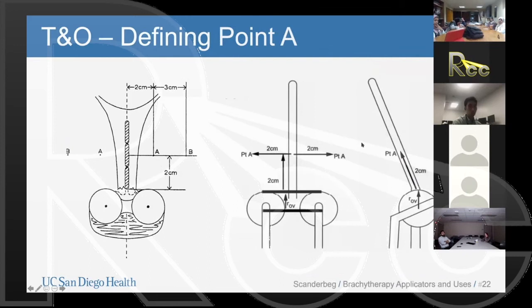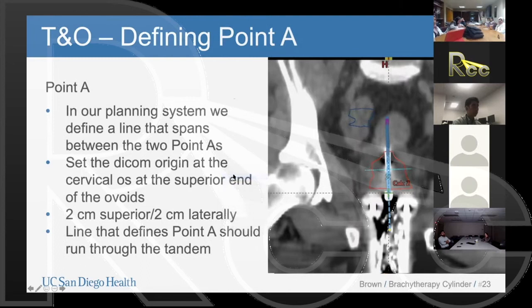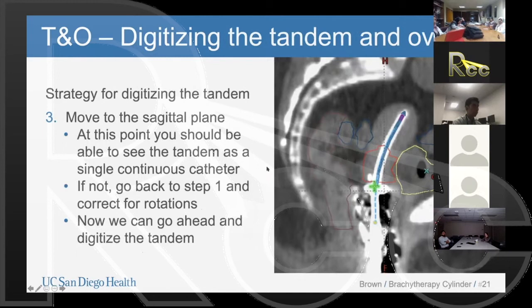No, unfortunately, I don't have that image. I should have in here an image of what it would look like if you still needed to do some rotations, but I don't have that in here. In any case, what you're looking at here is very, what's the right word for that? Clean is the only word that comes to mind, but you can tell that you're on the central part of this tandem. If you weren't, then it would start to fade away here, and you would have to scroll through this image in order to see the rest of the tandem.